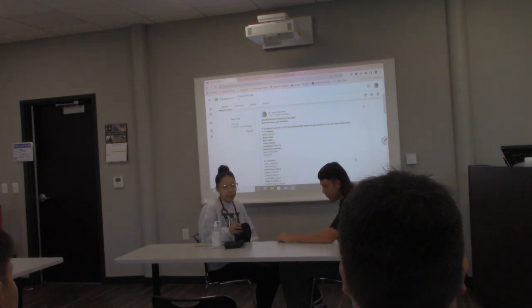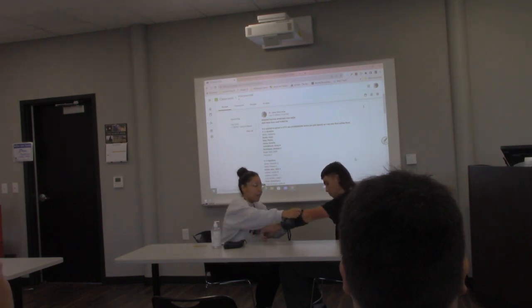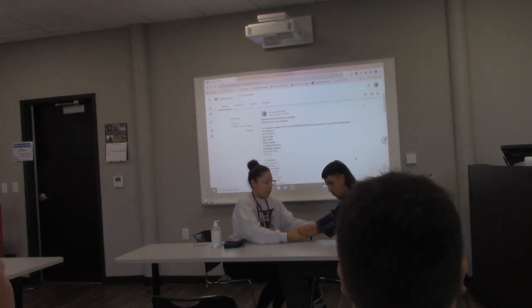You can find blood pressure cuffs at a place like CVS — they do come with a stethoscope, though I bought my own. We're going to place the cuff on their arm here.